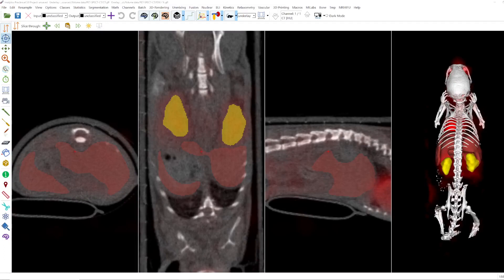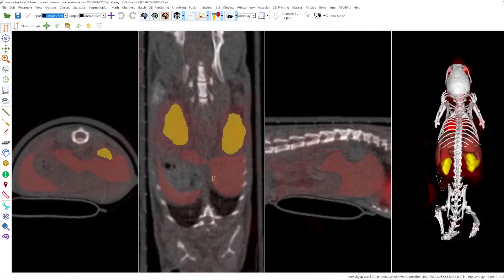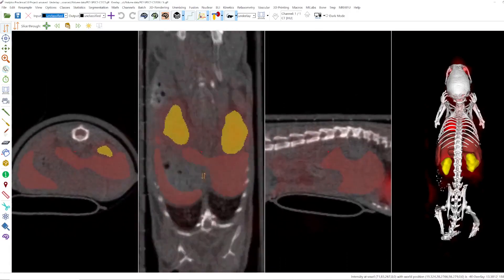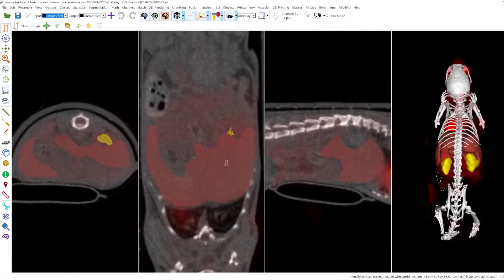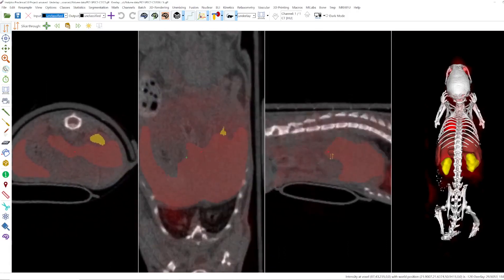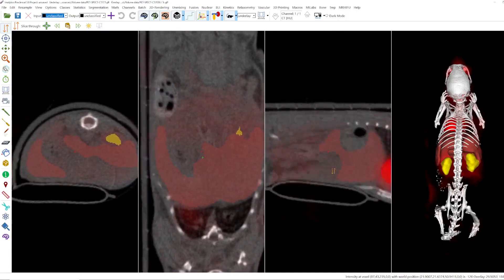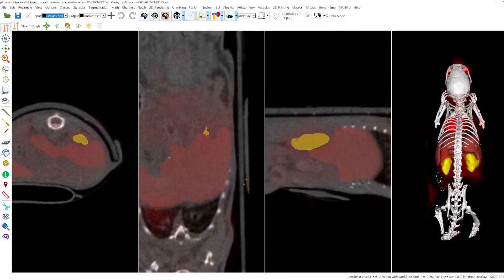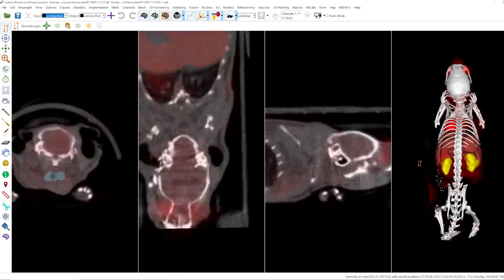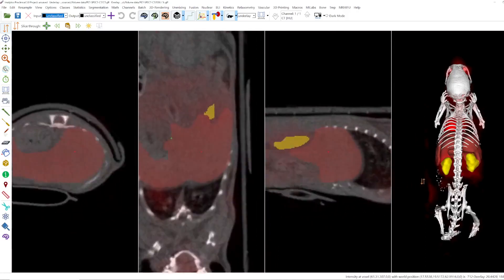This function is used very often because you can use it to slice through the 2D slices of your sample — for example the axial slice view, the coronal slice view, or the sagittal slice view. So it works only in 2D, not in 3D.